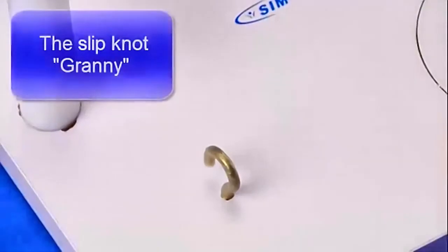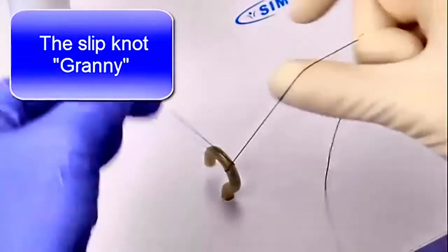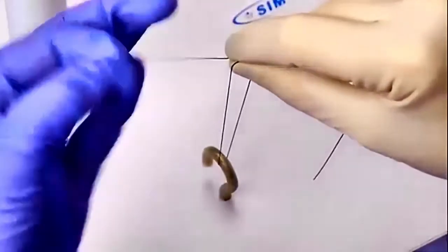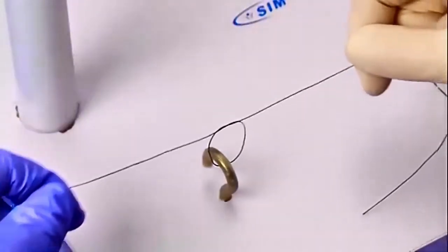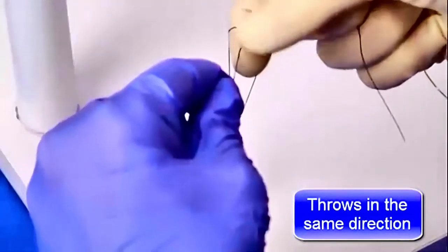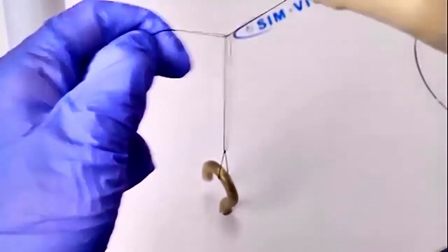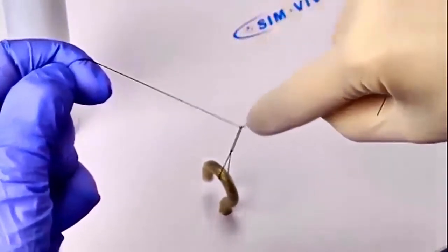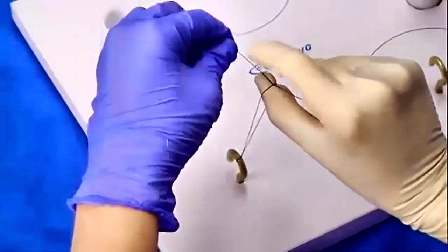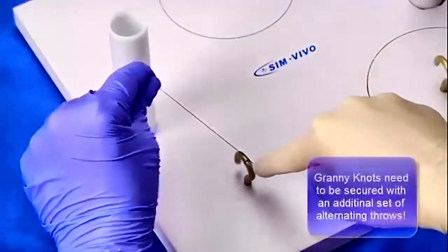There will be some occasions in which a slip knot will allow better control of the tension placed on a knot. A slip knot differs from a square knot in that the first 2 throws of the knot are not alternated. For instance, as in this demonstration, the thumb is used for the first throw and is also used for the second throw. Note that the loose knot can be moved down towards the hook for appropriate tension to be applied. For these 2 throws, at least 2 more alternating ones should be placed to secure the slip knot with a square knot.